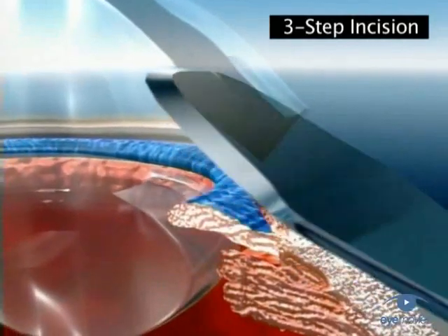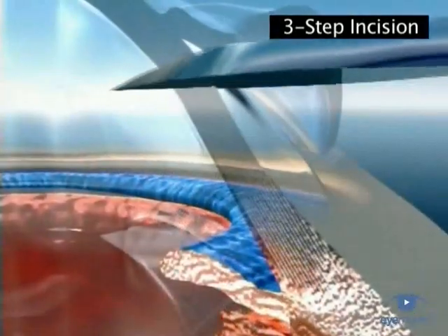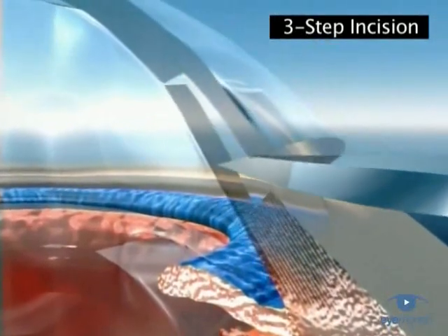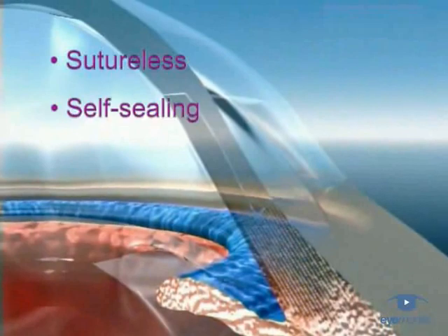This video has been produced to try and help you avoid these problems by giving you a better understanding of the principles of wound construction. This should help you to make incisions that are correctly structured and therefore sutureless, self-sealing, and astigmatically neutral.